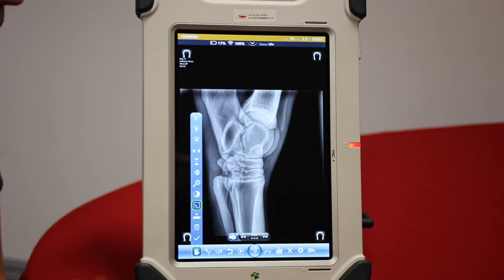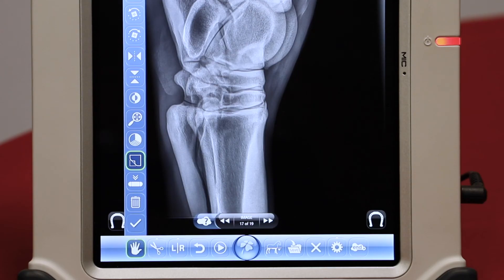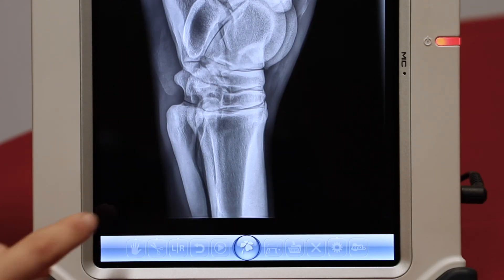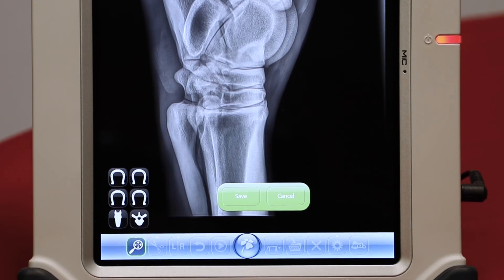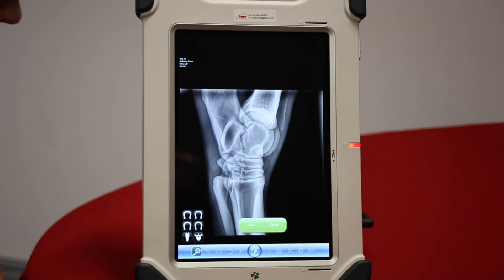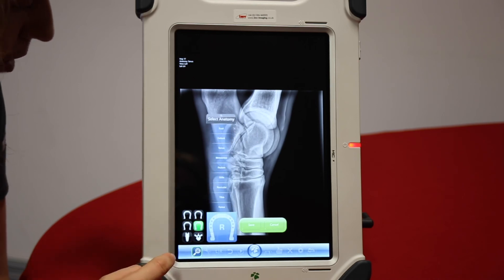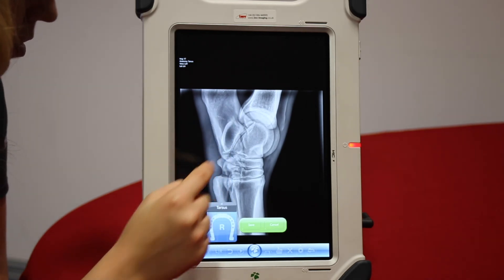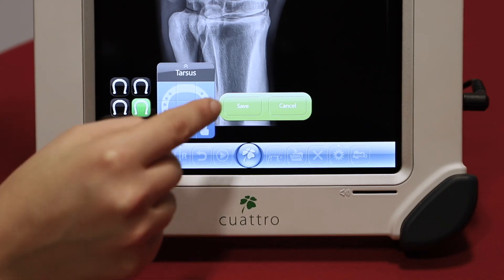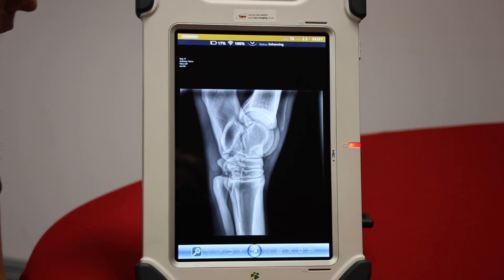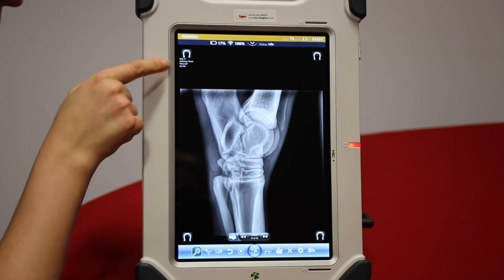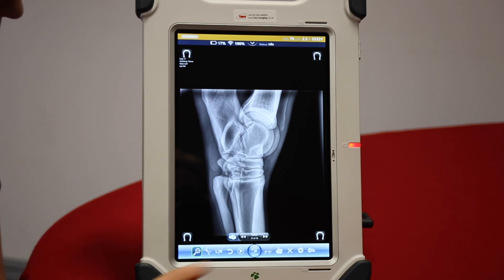If you have taken the left hind and actually it was the right hind, we can change that. Pick the view that it actually was and save, and it will flip it from left hind to right hind. Again, save any changes.